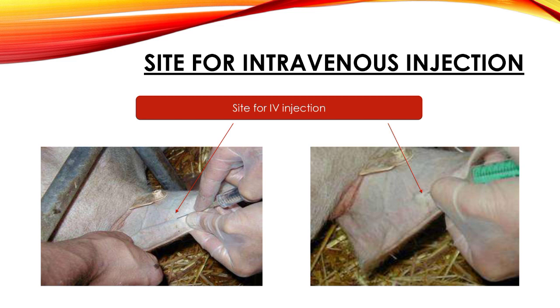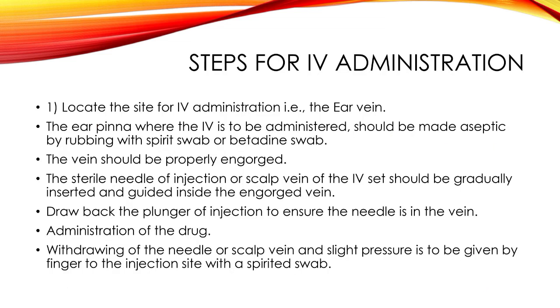In this picture, the site of intravenous injection is shown. The ear vein at the ear pinna was engorged by applying a spirit swab. Then the needle is inserted. Now, the steps to be followed for giving an intravenous injection.